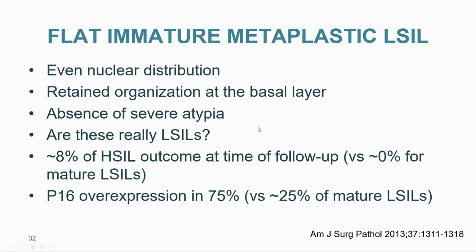And that's what has been questioned in the past. Are these really LSILs? Not only because they look immature and they're losing maturation, but also because there is an 8% possibility of an HSIL outcome at time of follow-up, which contrasts with the conventional low grades in which that outcome is lower when they're mature.